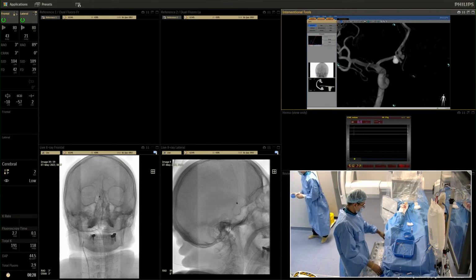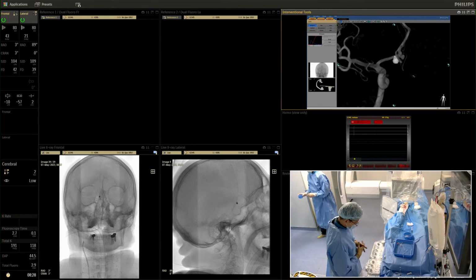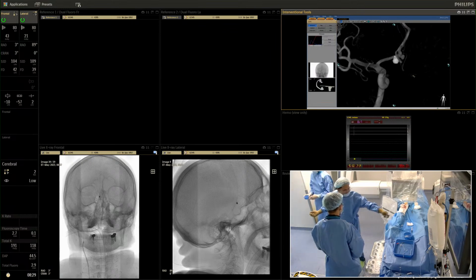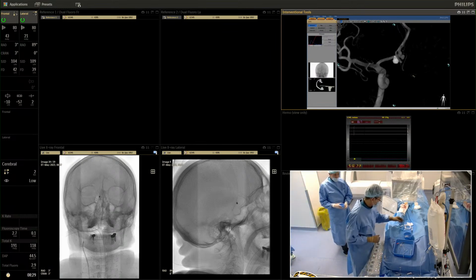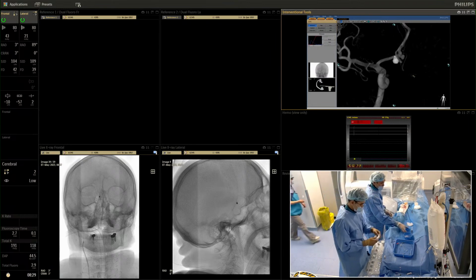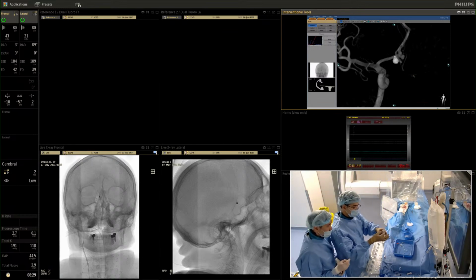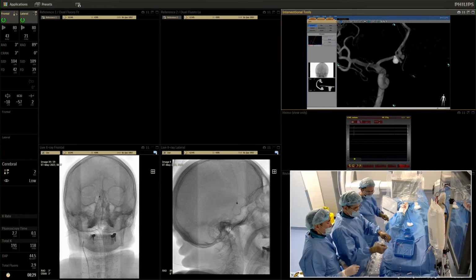It was expected IC aneurysm, but on IC there is an infundibulum of PCOM, and the second aneurysm on ACA territory. That's why we gave general anesthesia, and now the female is 65 years old.